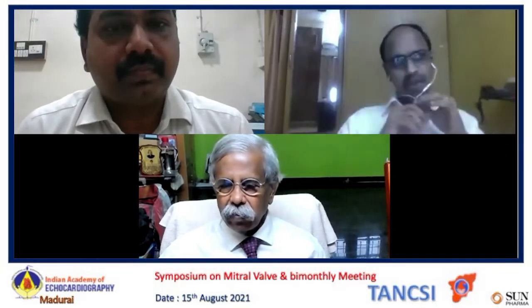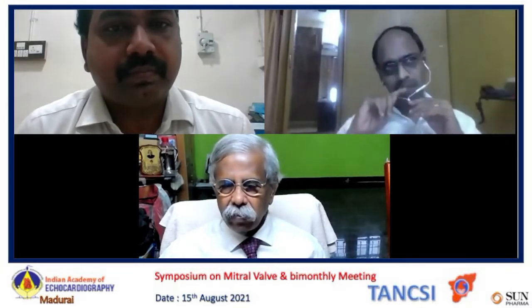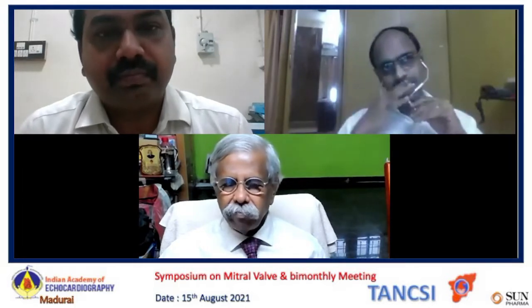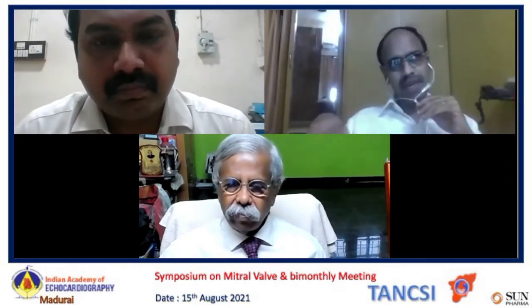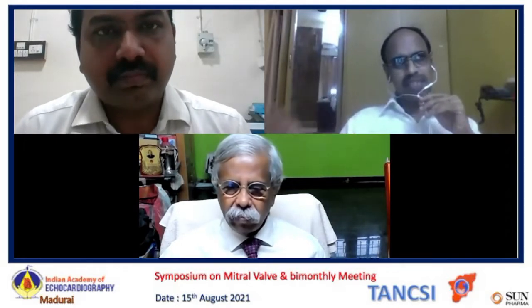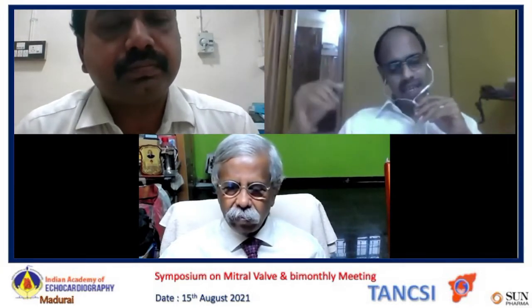In the brief suprasternal color flow view he showed, during systole there is antegrade flow, but during diastole there is a reversal, which means the ductus to some extent is supplying even the arch of the aorta. So part of the cardiac output from the left ventricle is supplied through the VSD from the RV, and part of it is through the right ventricle to the pulmonary artery through the ductus, especially in diastole. So it's an unusual survivor.